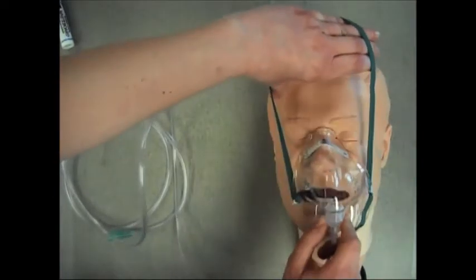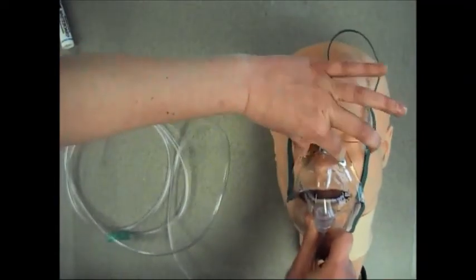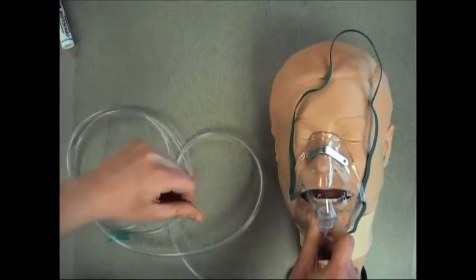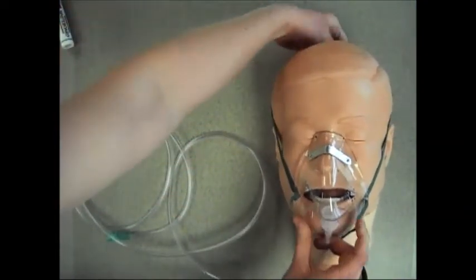I'm going to demonstrate that for you. I've got the nose piece conformed to the patient and then the straps go around the patient's head.